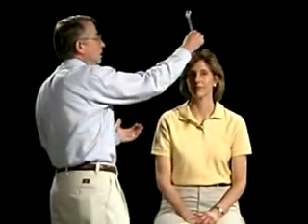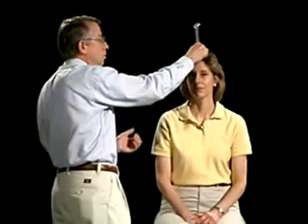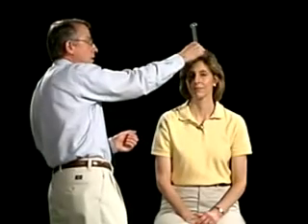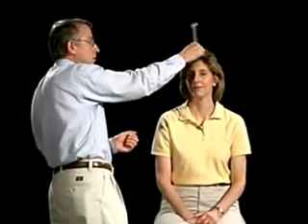We can further test that by doing the Weber-Rinne test. The Weber test is using a tuning fork, placing it on the forehead. Do you hear that on one side or the other, or the middle? The middle.